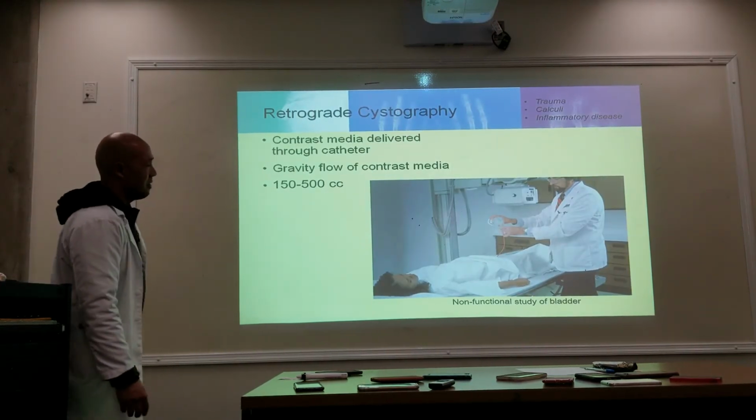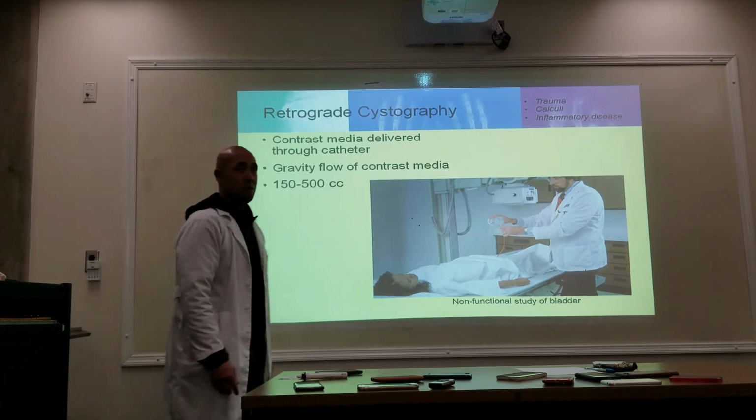Retrograde cystogram, you have to cath the patient, urinary catheter.